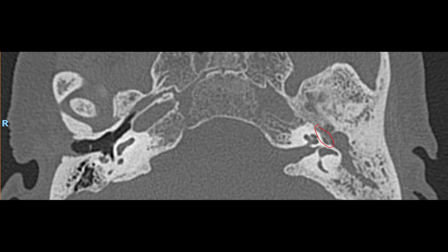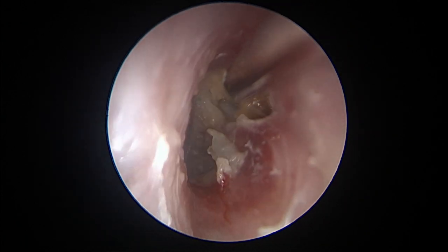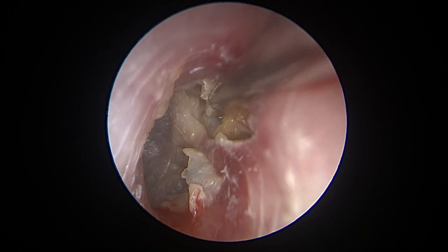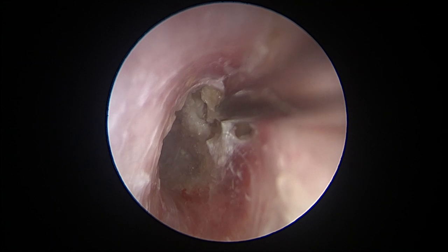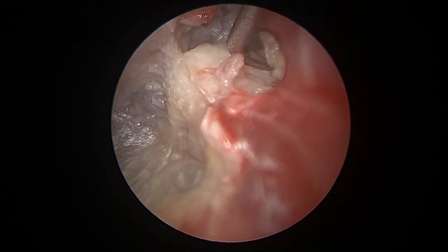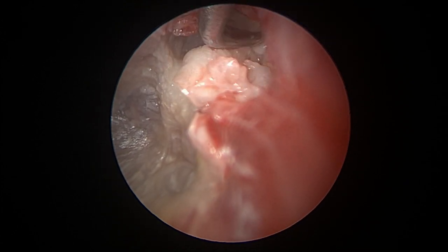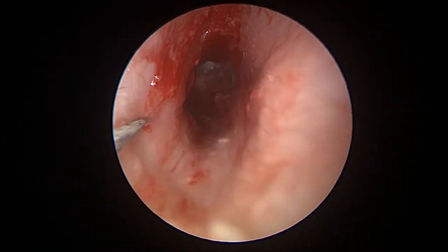We start as usual by cleaning the canal and also the Attica retraction from cholesteatoma. This helps us to measure the depth of the cholesteatoma, and the approach we will end with is either a total endoscopic ear surgery or a combined endoscopic transcanal, transmastoid removal of the cholesteatoma.